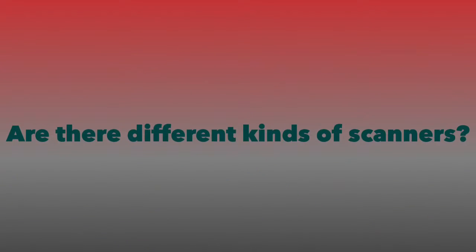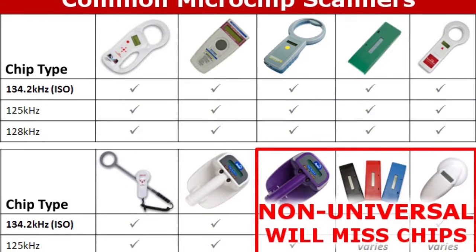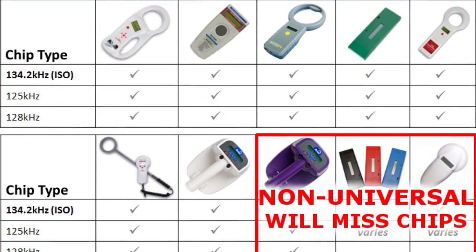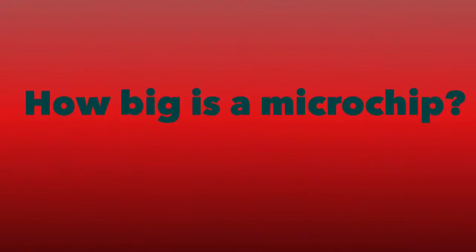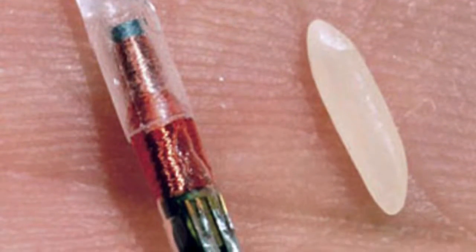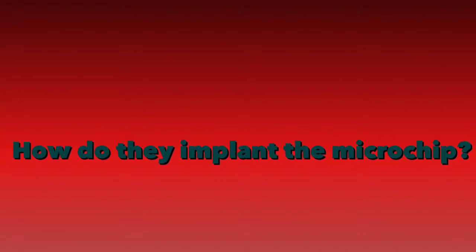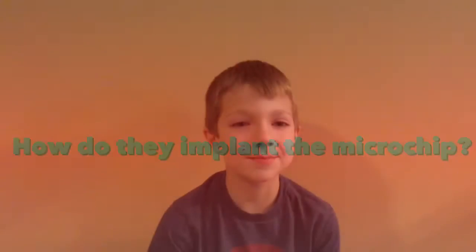Other animals besides cats and dogs get microchipped. A microchip is about the size of a grain of rice. It is put in a needle and injected under the shoulder blades.